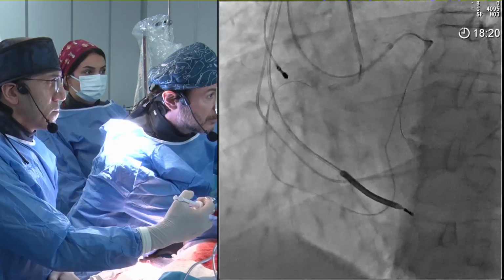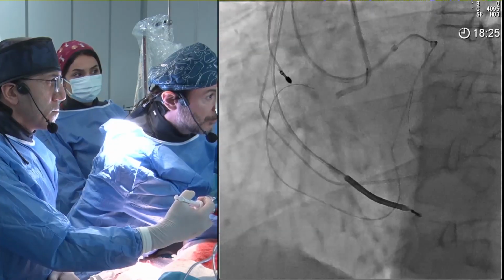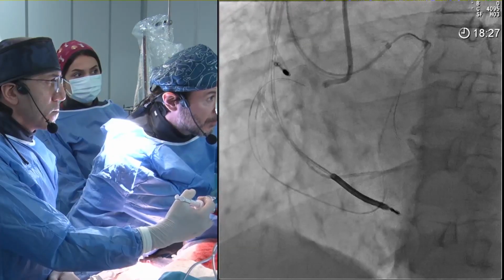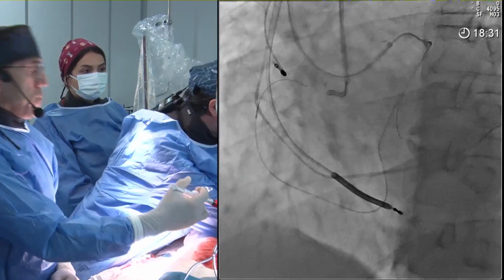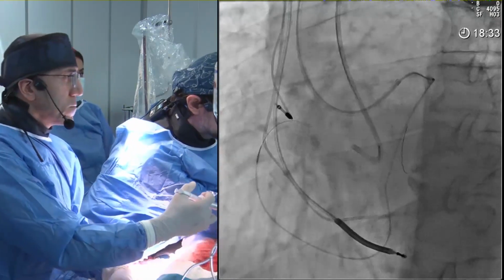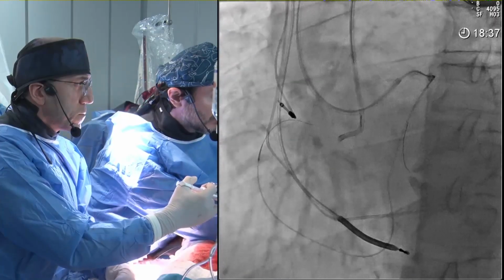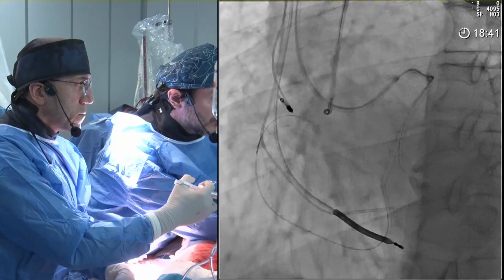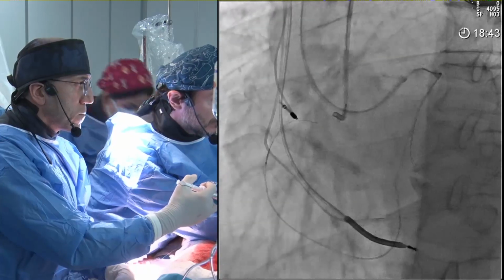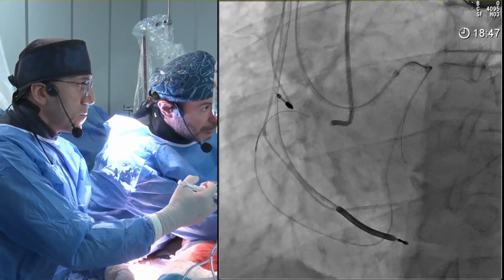So if you've gone through a septal approach, I believe you can get balloons retrogradely. If you get a balloon to the RCA ostium and balloon it, you have a target to puncture antegradely with a penetrative wire, resolving the ambiguity of the right coronary ostium and hence completing the procedure. And in those kind of situations, as you're at the right coronary ostium, you probably want to use balloons with longer shafts like the Abbott balloons. They go up to 148 centimeters. So that's something that we mustn't overlook, the use of CART.